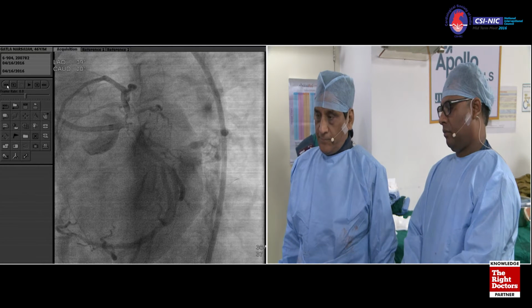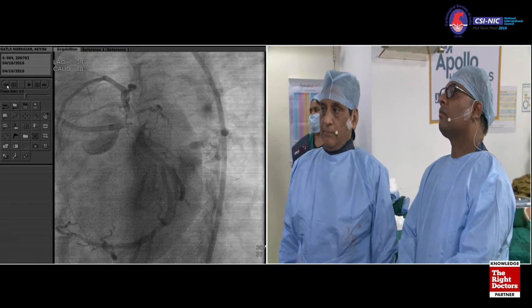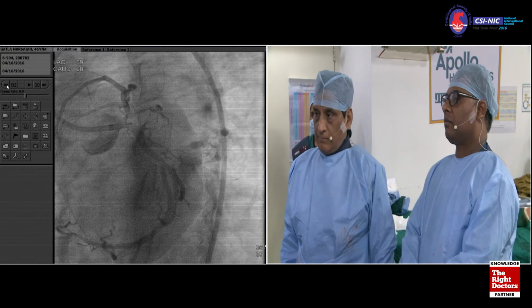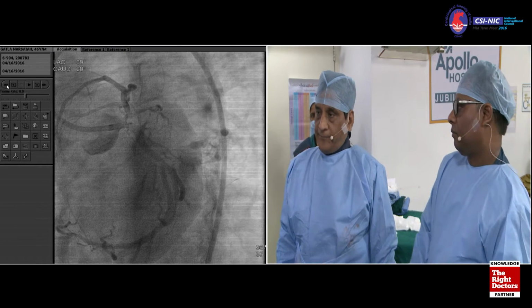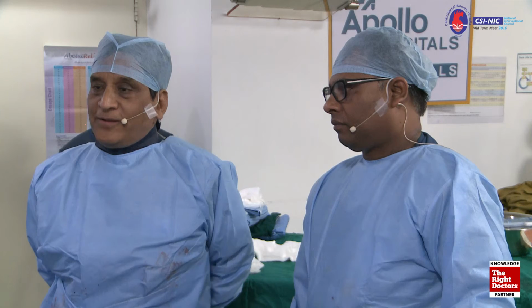I think it's quite successful and educational for mini crush stenting. But if you face this region again, will you consider dedicated bifurcation stenting for this region? Well, I can tell you that so far what we have has not been great. The other bifurcation stents have had issues so far. But yes, one day when we have a good bifurcation stent, sure, these cases will use them.